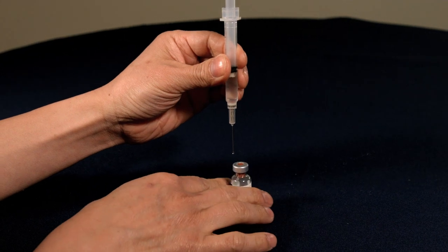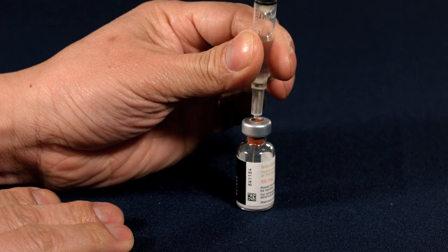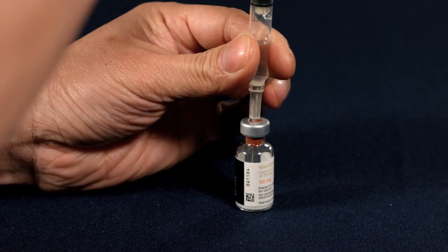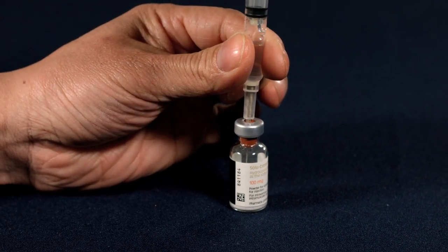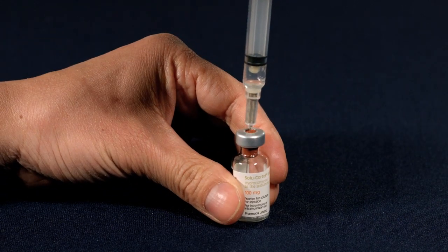Insert the needle into the Solucortef bottle. Slowly depress the plunger to release all the water and leave an air gap inside the syringe.